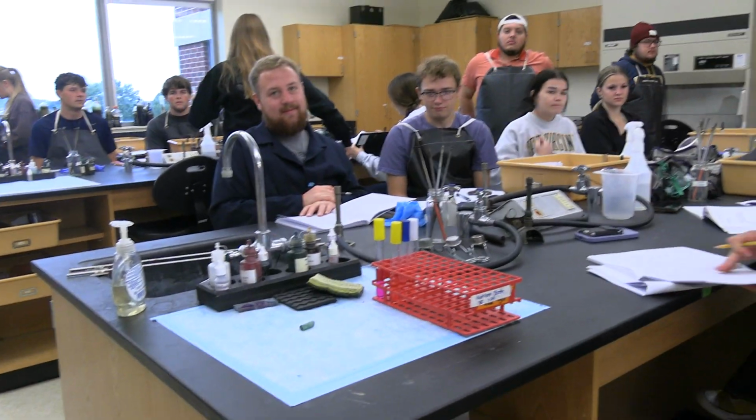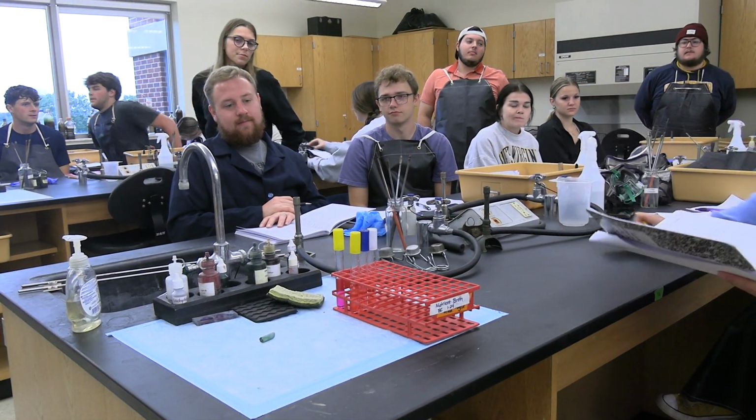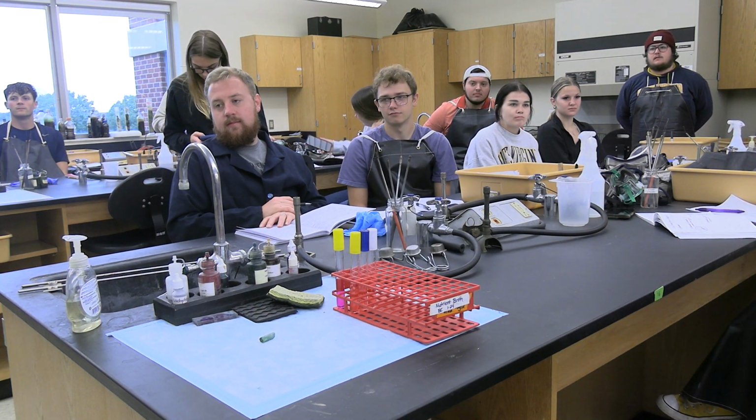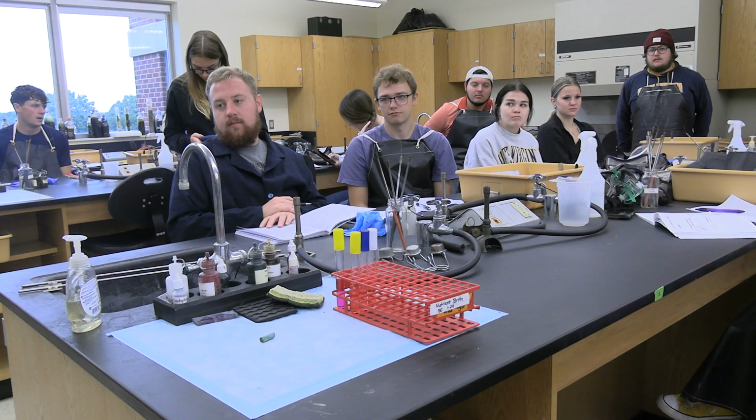I know it's simple, but I still wanted to do it, because I would love everybody to get it. Otherwise, you're very confused about what it looks like.